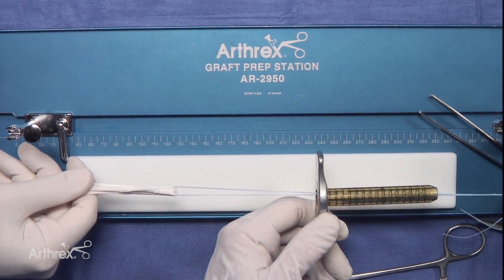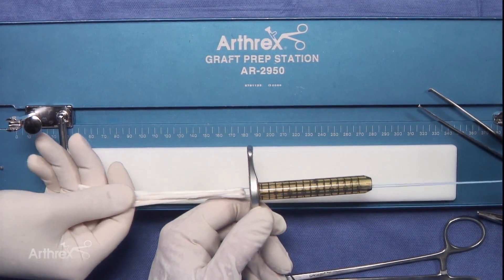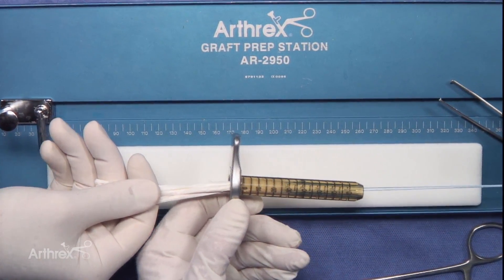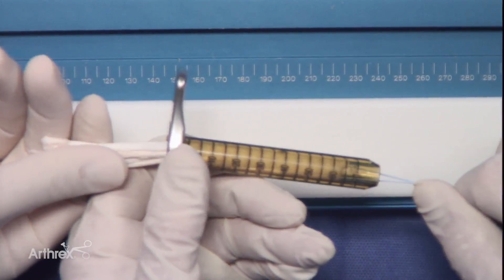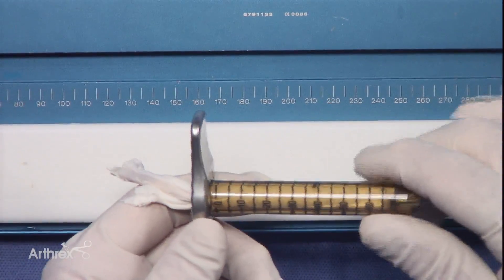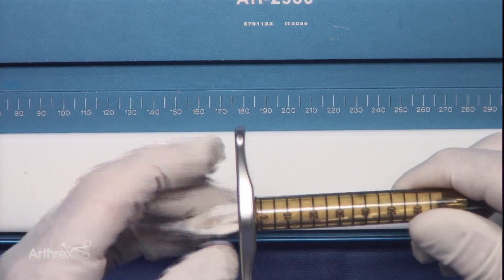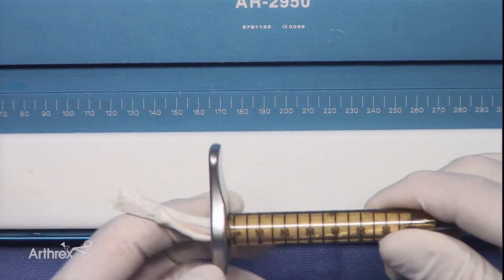This is a demonstration of a 7-millimeter diameter tube, and even though we compressed the graft, 7 millimeters would be a smaller diameter for us to utilize. Studies have shown that there's an increased failure rate, so we'd like to be able to increase the diameter of this graft.